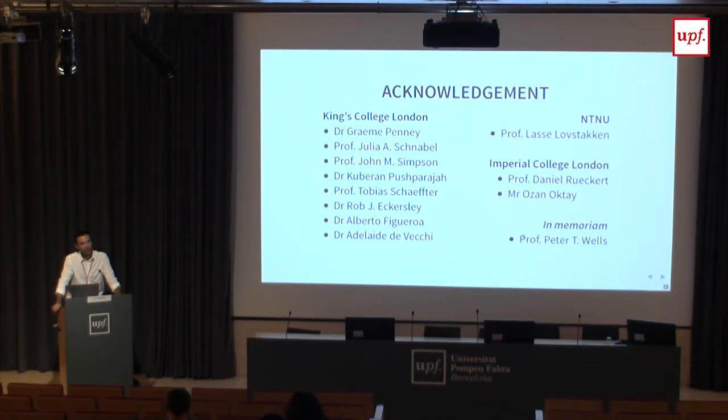The other very interesting thing about deep learning, from some work we have been doing, is that if you use convolutional neural networks to do segmentation on data, not only will you get segmentation, but you will get patterns of how the network recognizes your image. In other words, you will locally see what parts of the image have made the network, for example, classify your image or carry out your segmentation. And this basically gives you an idea of what makes the machine think that this is, say, a four-chamber view. And actually, that correlates quite well with anatomy. So this could be used as well, trying to dig into the networks and not see them as a black box, but rather as something that is mapping the image in some way. And then you can do fancy things with that as well.